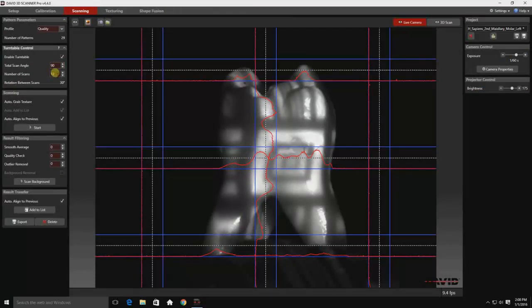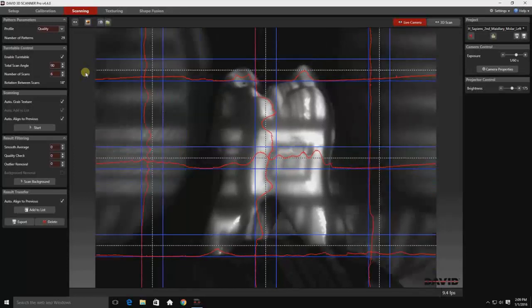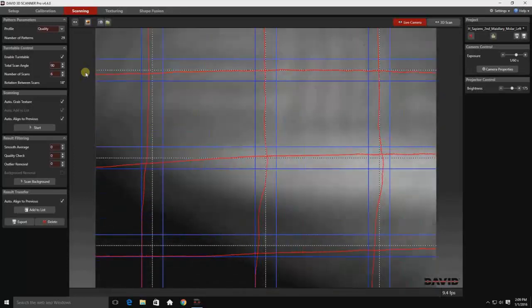Now as we prepare to scan the top and bottom of the tooth, we don't need to do a 360 degree rotation. 90 degrees will suffice, as we're only looking at a small portion of the tooth. We've already seen all the sides. So I'll be taking a total of six scans, which gives us 18 degrees of rotation in between each scan. We won't necessarily be using all of those scans, but we're here, we're set up, we're gathering data right now to build a model later. That's very important.